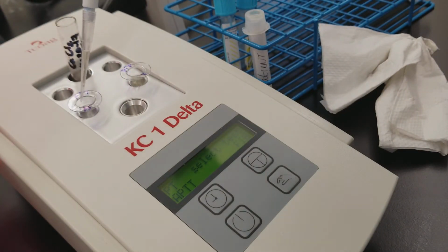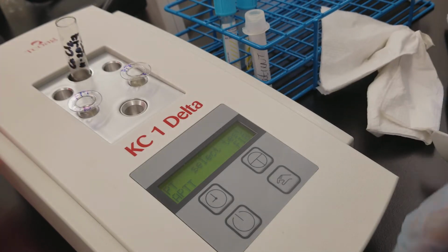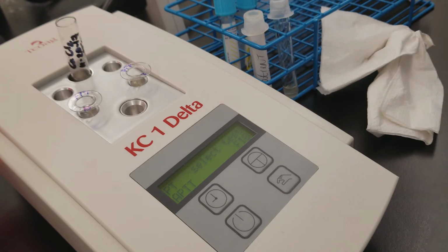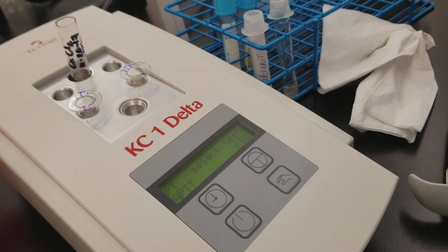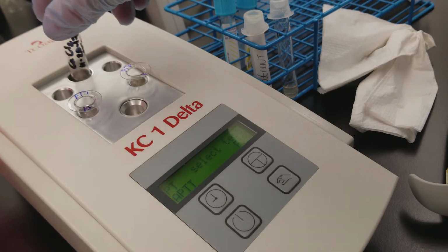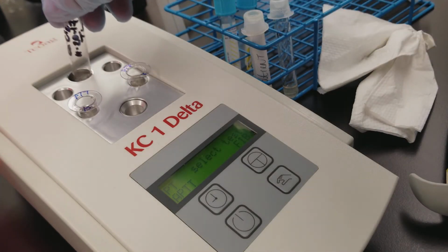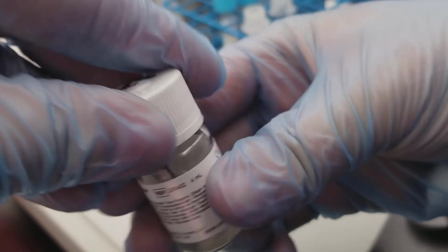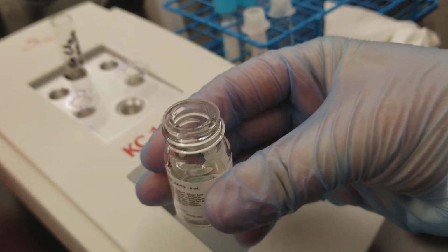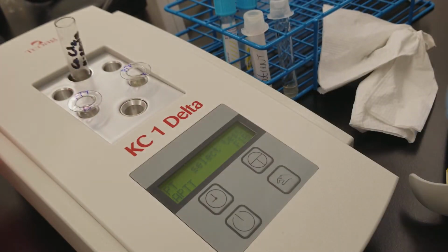So let's put 15 in there. I'm pressing down on the button. Okay, now I'm gonna get rid of it in the biohazardous bag. Okay, and now we're going to add the PTT reagent, not the calcium chloride. Okay, that's preheating. We're going to swirl the PTT reagent. We're going to open it up. All right, there's no rubber plug in there, so that's nice.